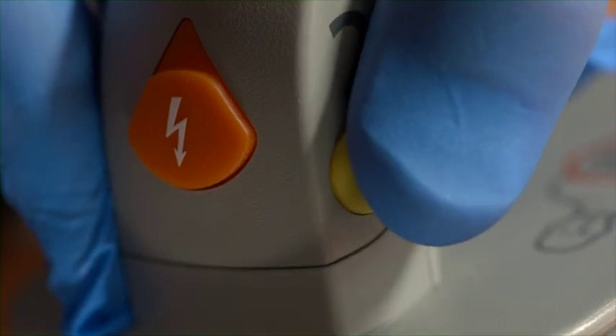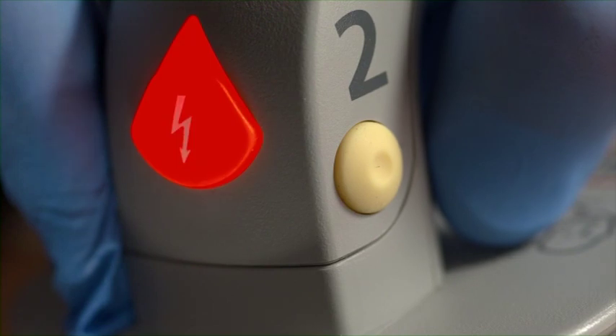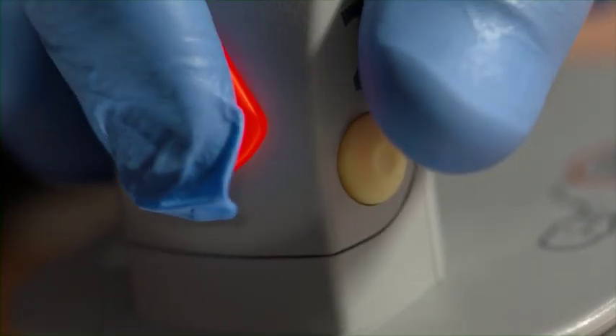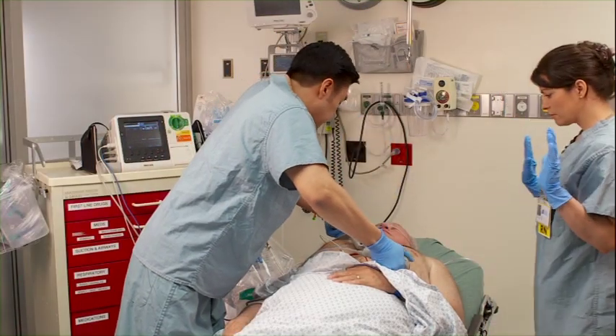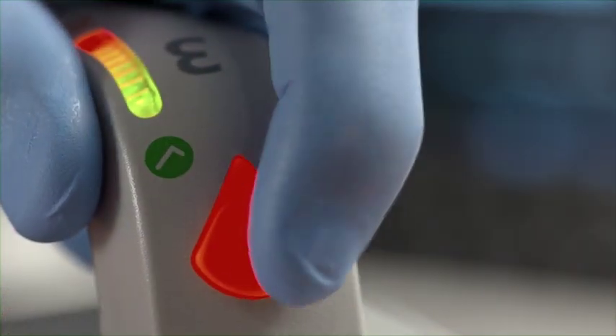Press the charge button on the paddle. The orange shock buttons on the paddles flash to indicate the defibrillator is charged. Make sure no one is touching the patient or anything connected to the patient, then press both shock buttons.